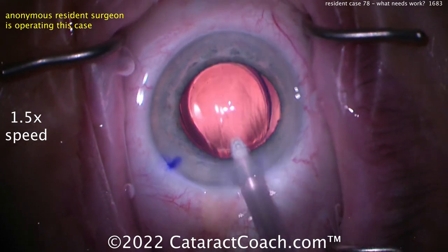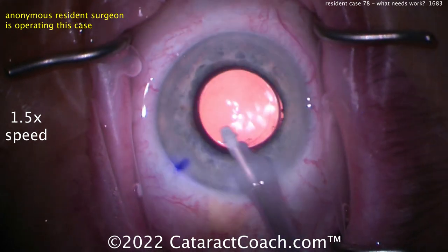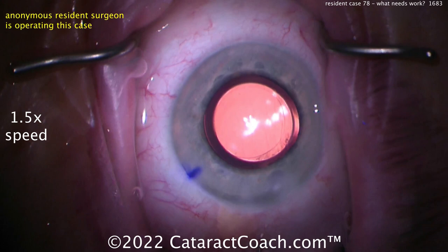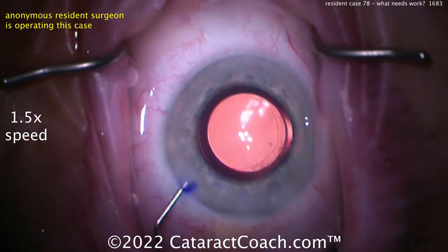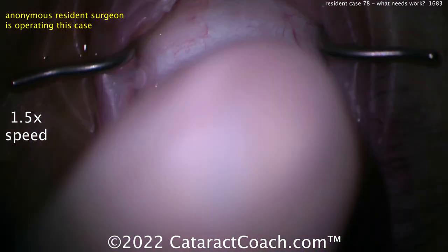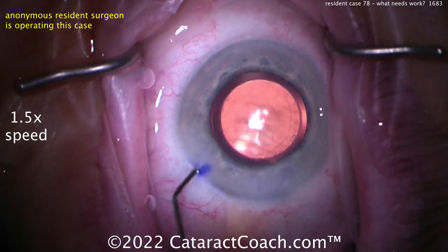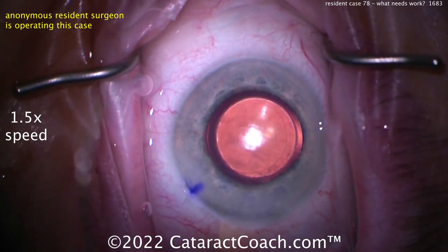Looks like a single-piece monofocal acrylic lens. Using the second instrument to get it in the bag — good job. Another tip: if you rotate the lens a little bit as it goes in, it's sometimes easier to get underneath the optic. Your haptic is right under the incision so it's a little harder. You definitely want to be able to go underneath the optic to remove viscoelastic — because once you do toric lenses, that's imperative. The hydration looks good, not too aggressive, a little bit on the sides. The rhexis overlaps pretty nicely — maybe 4.6 to 4.8 mm. Hydrate the roof of the incision just a little bit — there you go. Checking the pressure, you can use the cannula to touch the cornea instead of your big finger.